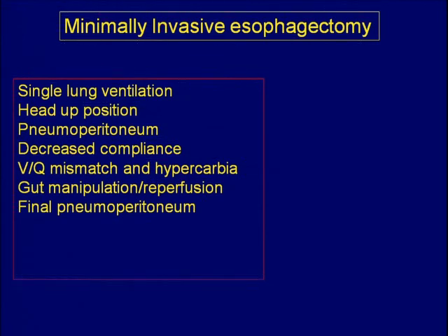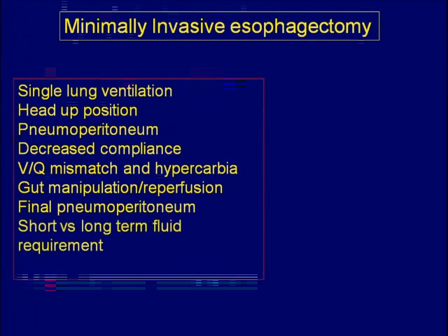And at the end, once we've reached an equilibrium, we often do another pneumoperitoneum for another laparoscopy, and we hit them again. And the big question of all this, obviously, is where do we stand for short versus long-term fluid requirement? If we give them a lot intraoperatively to offset this, but then we take away the insult, is this going to come back to haunt us postoperatively?